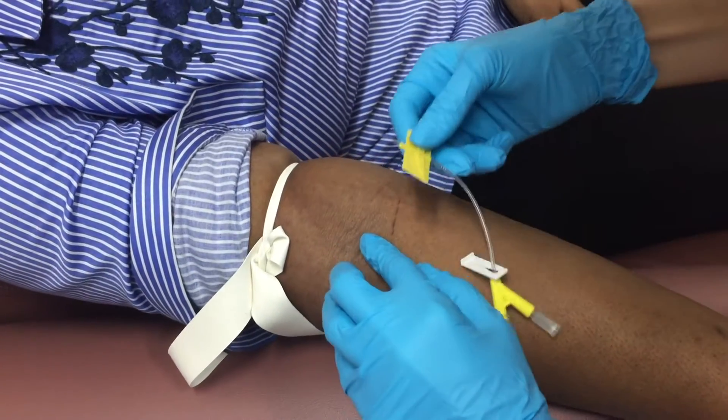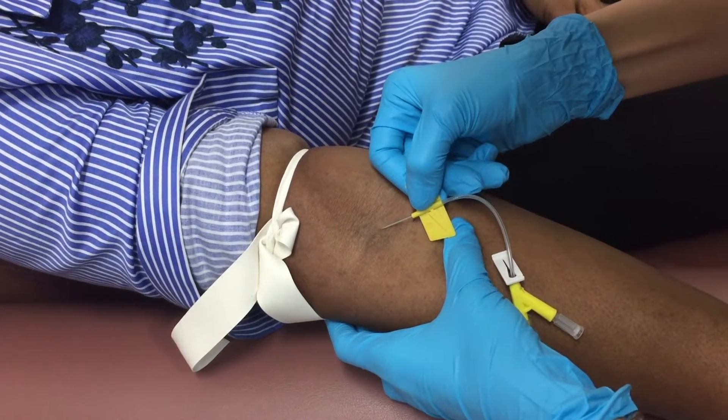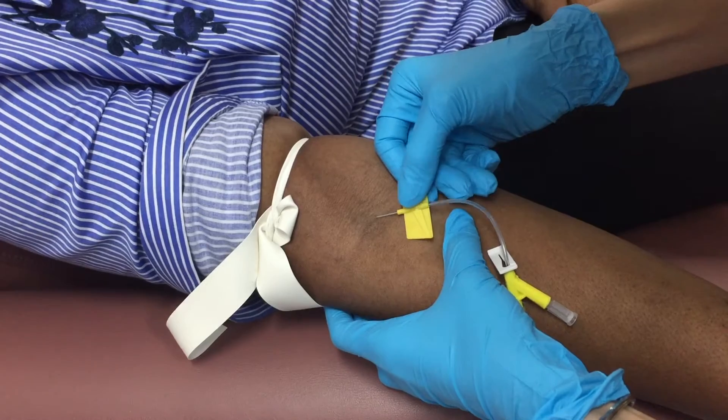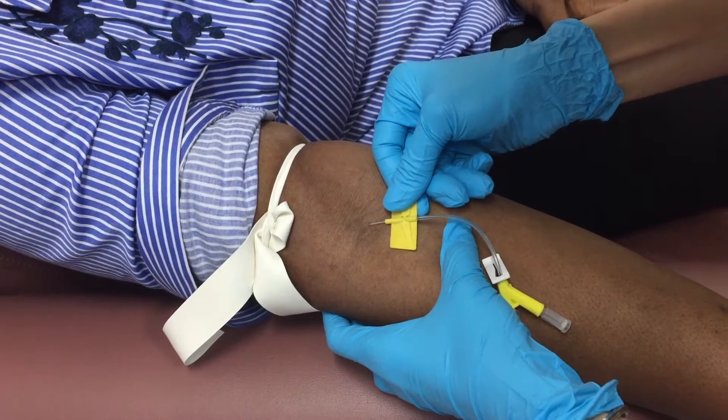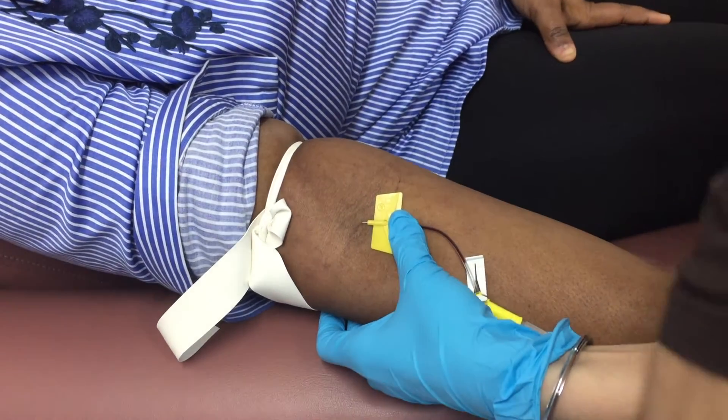Make sure to have a very good grip of your needle, bevel up, and just advance the needle into the vein. Once you see that there's blood return, it is a very good indication that the tip of your needle is inside of the vein.